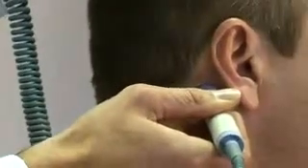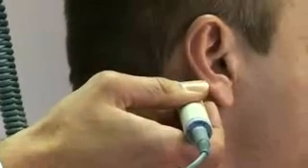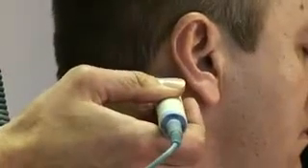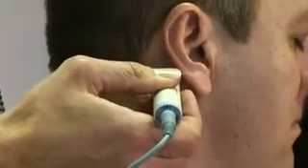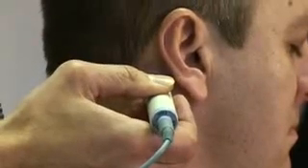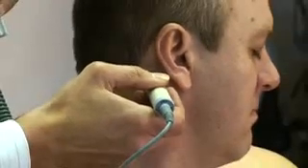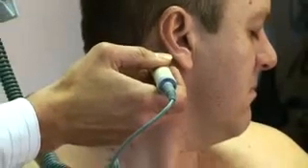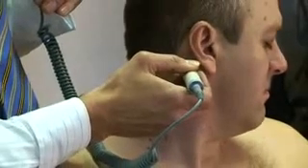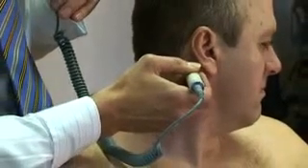We now attempt to insonate the vertebral artery whilst turning the head to the left. At this point we commonly lose the sound of the artery and have to re-search for it. This demonstrates normal flow in the artery at the point of full rotation to the left.